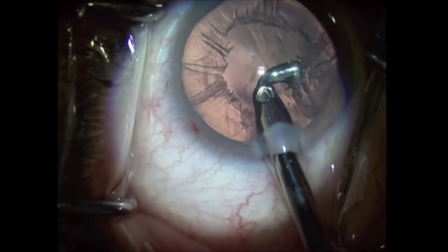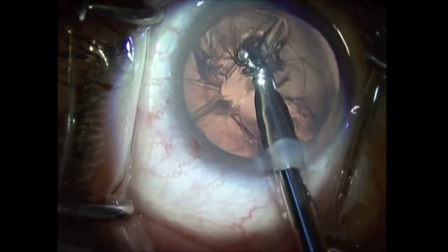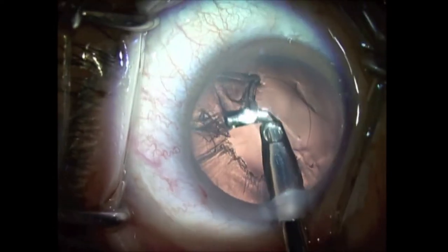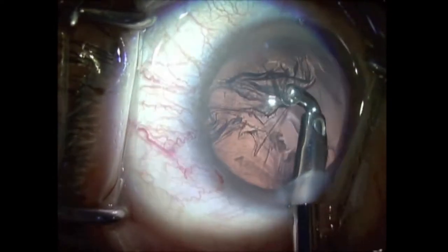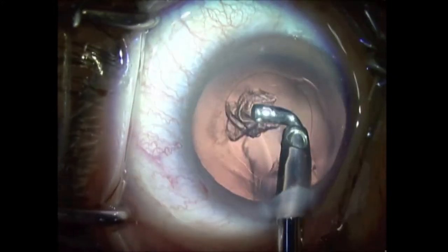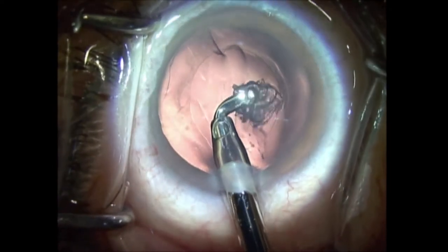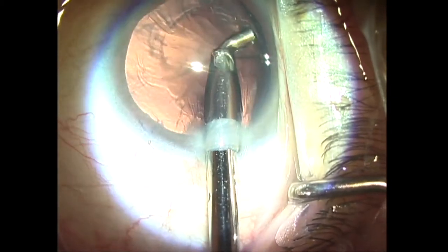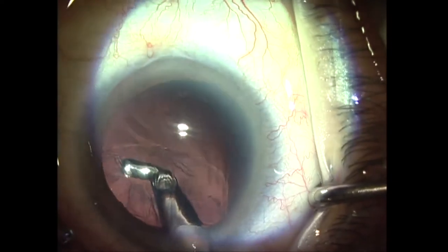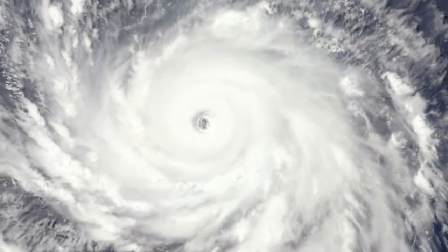Along the years, observing different surgeons and analyzing their practices in detail, we noticed that aspirating the neighboring cortex material in a tangential way, one after another, could accelerate and make the entire aspiration much easier and faster. A lot of practice led to the development of a continuous tangential one-step cortical aspiration movement, which we called the Hurricane IA Technique.